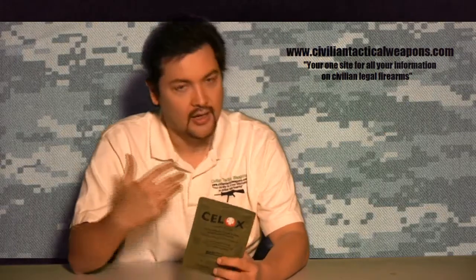The nice thing about this is if you had a gunshot wound in your arm or your leg, wherever, you'd go ahead and pour this onto the wound and it would actually help clot the wound so you would not lose so much blood that you'd go unconscious. Of course, after you've clotted the wound, you'd want to go ahead and put some form of a restrictive bandage or something to maintain pressure on the wound. Make sure that you actually hand this packet to the medical professional who comes and treats you, so they understand what's been used to treat you.